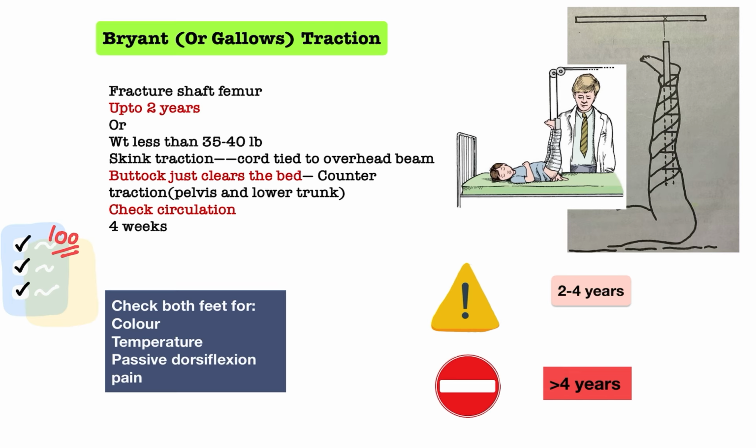So by these steps, we are checking for circulation.